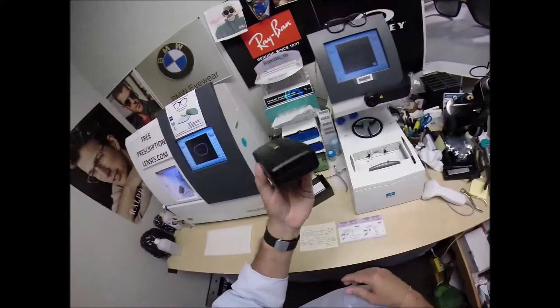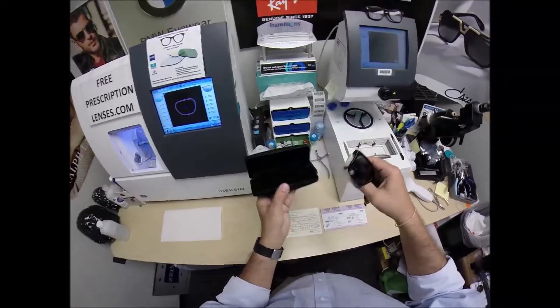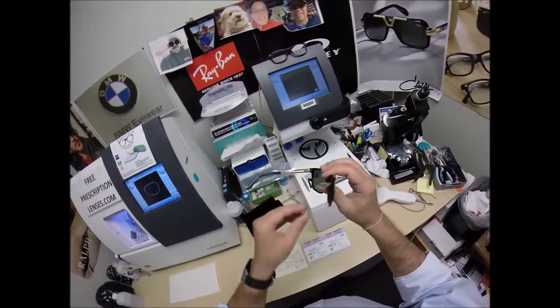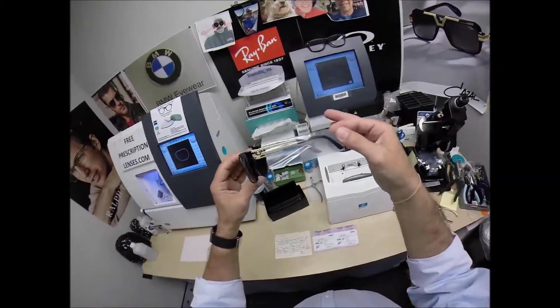But the star of the show, the main attraction is hiding inside this Italian leather Versace case, and here we are. We got the frame. Now, this is a sunglass. I'm going to take the dark lenses out and put the clear lenses in there.